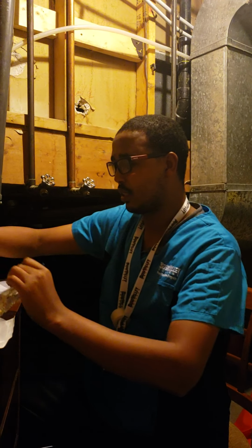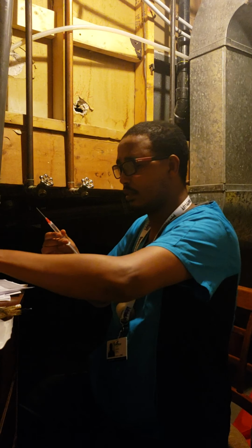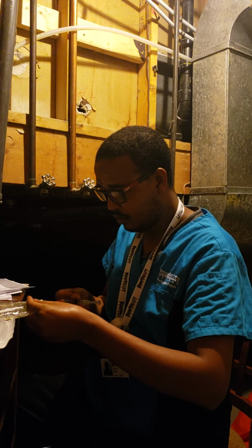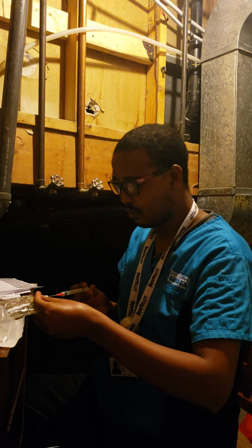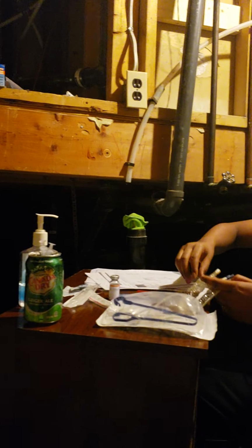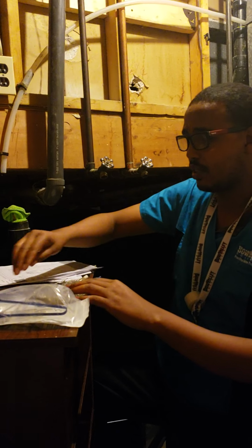Okay, put in a garbage. Then inject it. The syringe goes directly into the sharps container, and then mix the medication, and then write down the labeling.